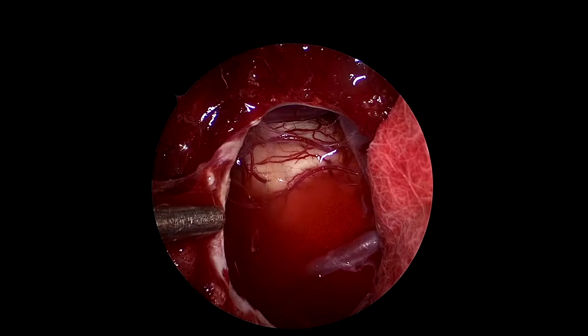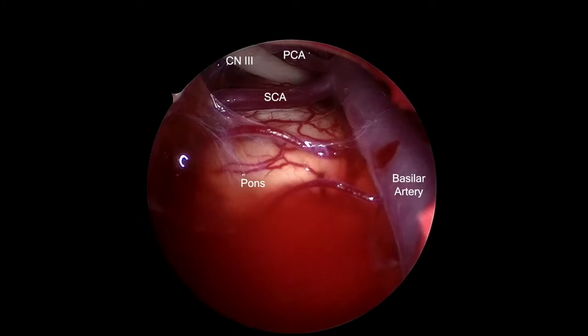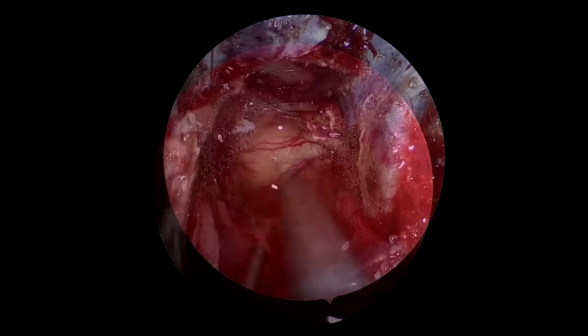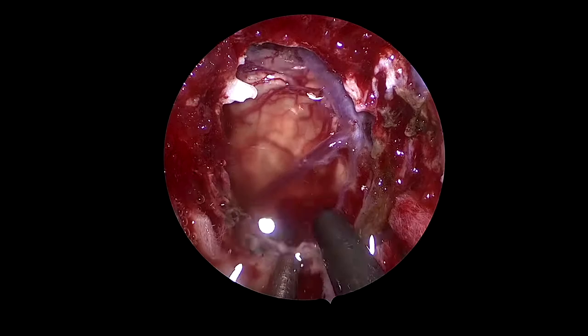The suspicious arachnoid is going to be sent to the pathologist as a margin. We can see the third nerve superiorly between the PCA and the SCA. We also send dural margins to the pathologist. Once they're confirmed negative, we proceed with the reconstruction.